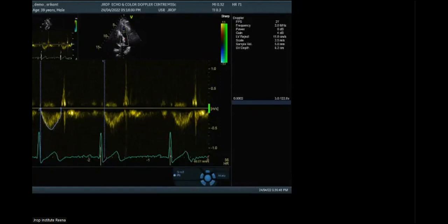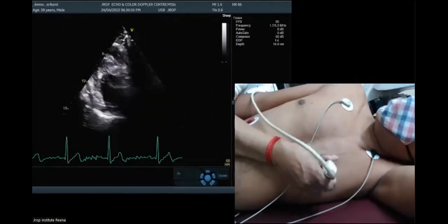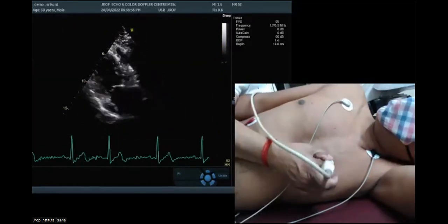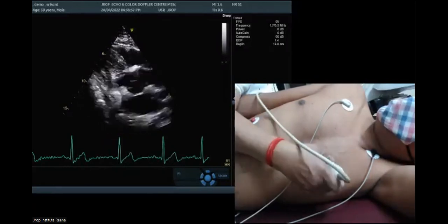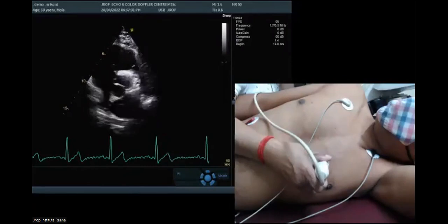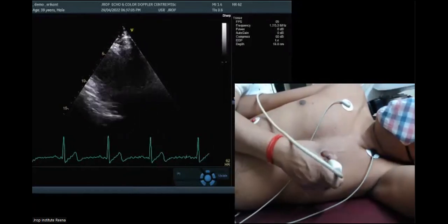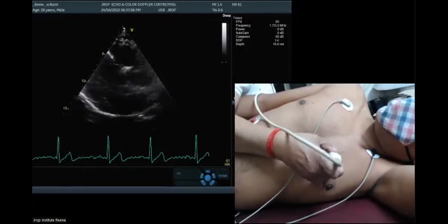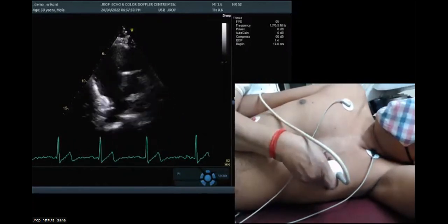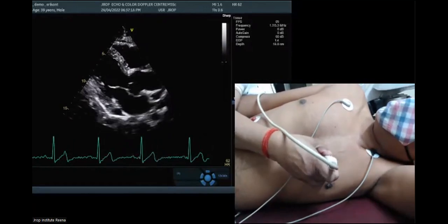Hiru, how long have you been doing echocardiography? Sir, I'm working in NICVT for 6 years. My God. So why did you join this echo course? Sir, I joined because I previously attended your class in the Dhaka chapter echo course. Okay. So I want to know everything, tips and tricks of yours, sir. Okay. You want to become another Rakesh Gupta, right?